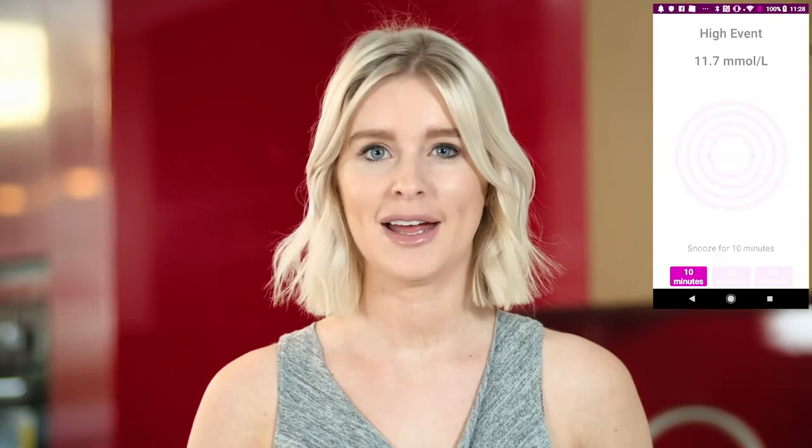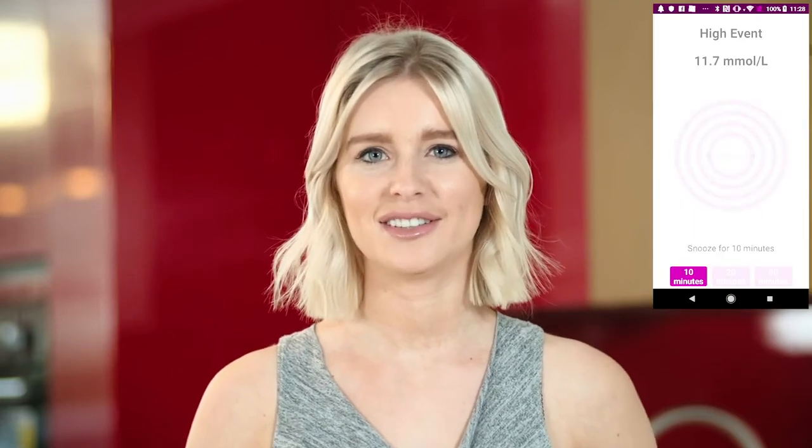The smart alarm feature allows the user to snooze the alarm in 10, 20, and 30 minute intervals. For highs and lows, you can set the GluNovo app to vibrate so it's discreet. But for urgent low, the GluNovo app will always alarm — this is to wake you up when you're sleeping.